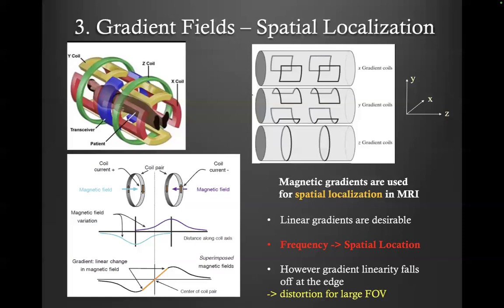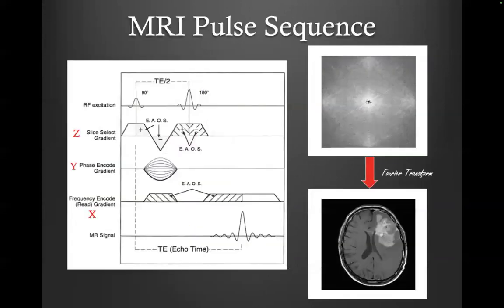And actually after this, you have a linear range in the middle, but outside of the linear range, you actually lose this linearity. And that's actually how you get MRI signal distortions and all these artifacts created by a non-homogeneous field, or a field that's not as you calculated or programmed. But anyway, those are again beyond the scope of this lecture.